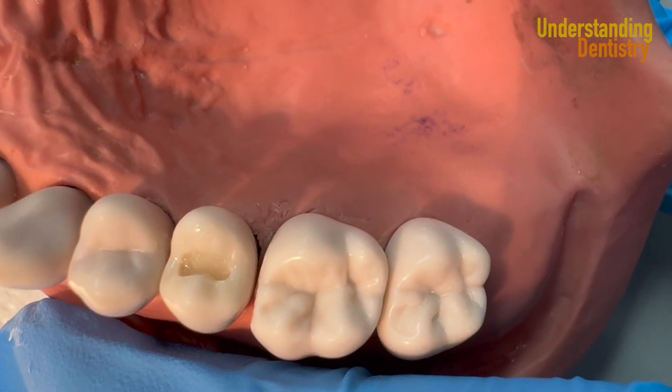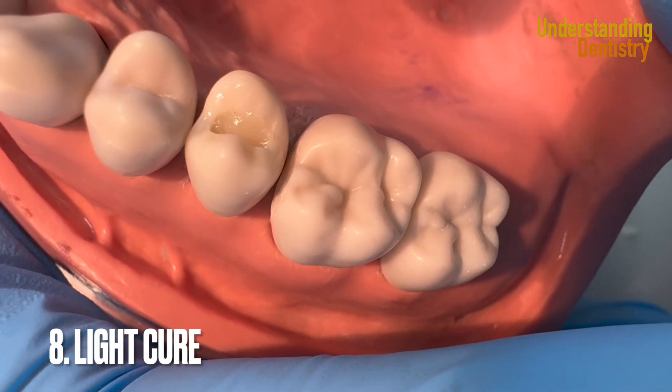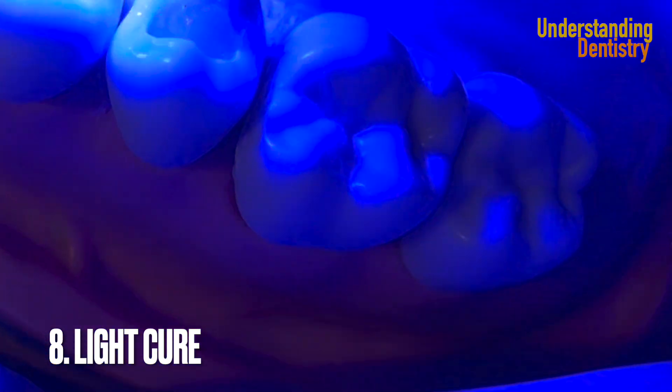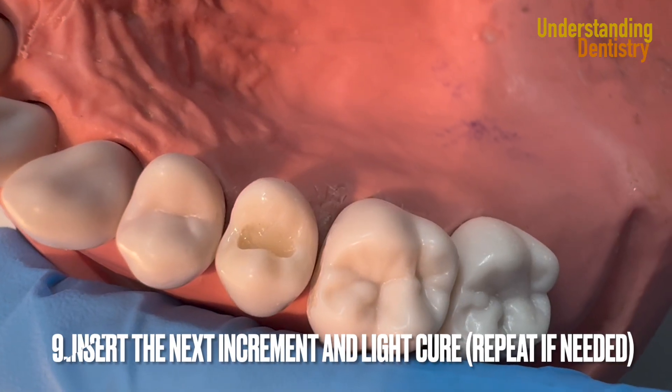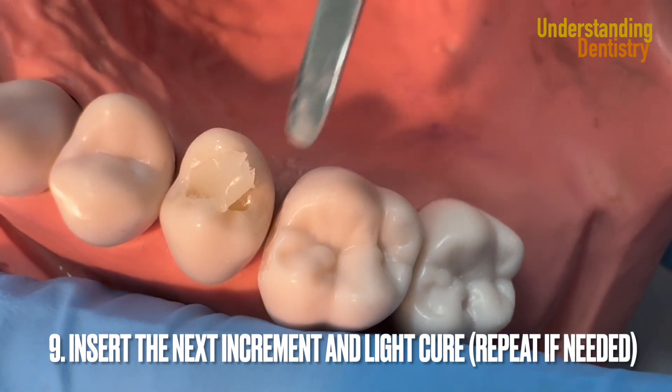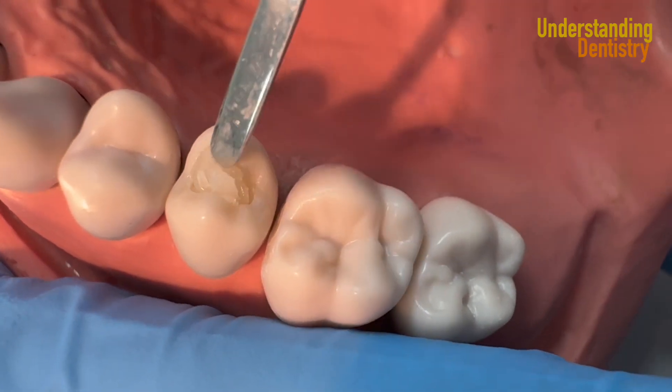You're packing the resin and making the anatomy at the same time, removing the excess — always with your instrument parallel to the existing surfaces of the tooth. Then you light cure and insert the next increments. That's the incremental technique.